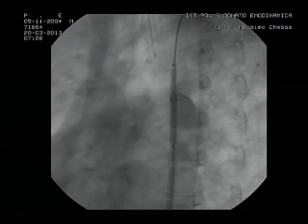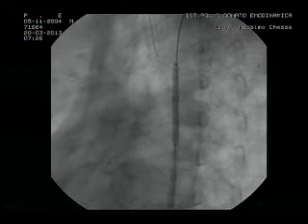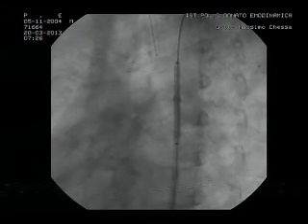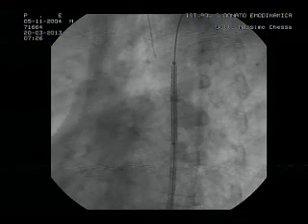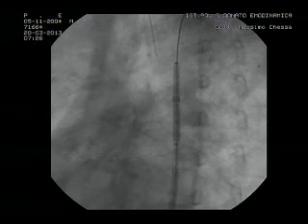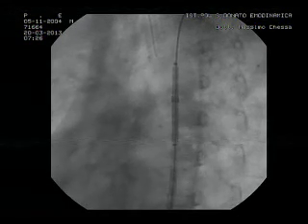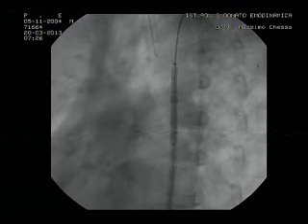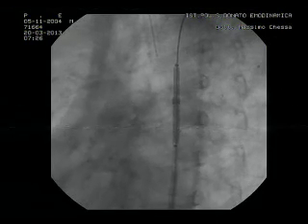Elkanan, any other comments before the end of the day? Yeah, I mean, I'm sorry about this. I would take the stent out, put the wire in the right subclavian artery, shoot an angio, and then make a decision. So Massimo, I don't know if you heard the end of that. Yeah, Elkanan had recommended, so you have a better idea of the precise placement, the transverse arches, to probably rewire to the right subclavian artery, so you're not bound by the left subclavian artery there, and then probably place the same stent and decide whether this is too long or not.